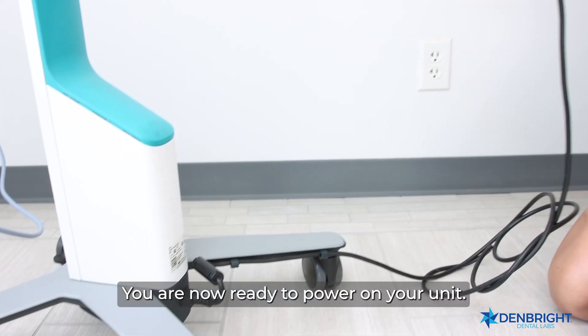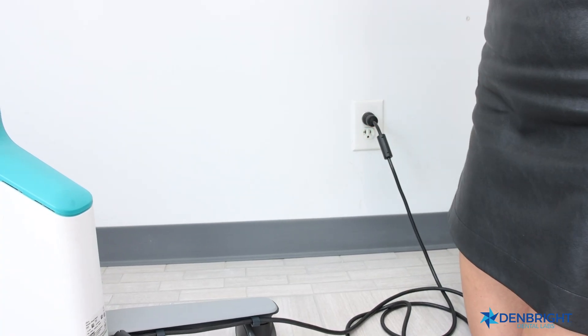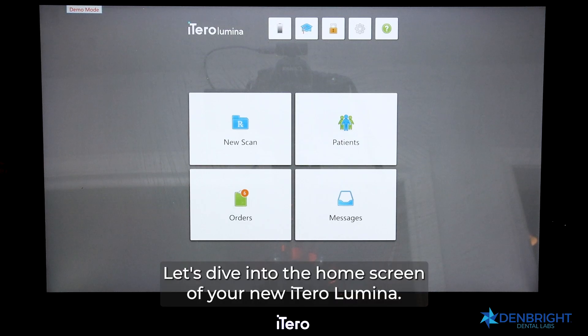You are now ready to power on your unit. First, insert your power cord and use the power button at the top of your monitor to turn on your unit. Let's dive into the home screen of your new iTero Lumina.